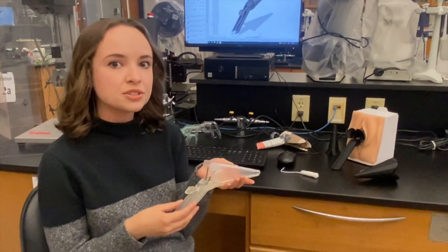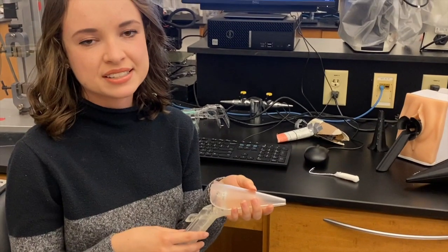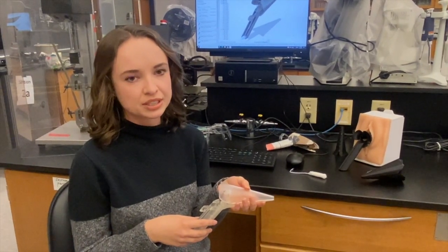The speculum also features three conical blades. This is to minimize the amount of friction experienced by the patient during use and prevents the need to rotate the speculum during insertion.